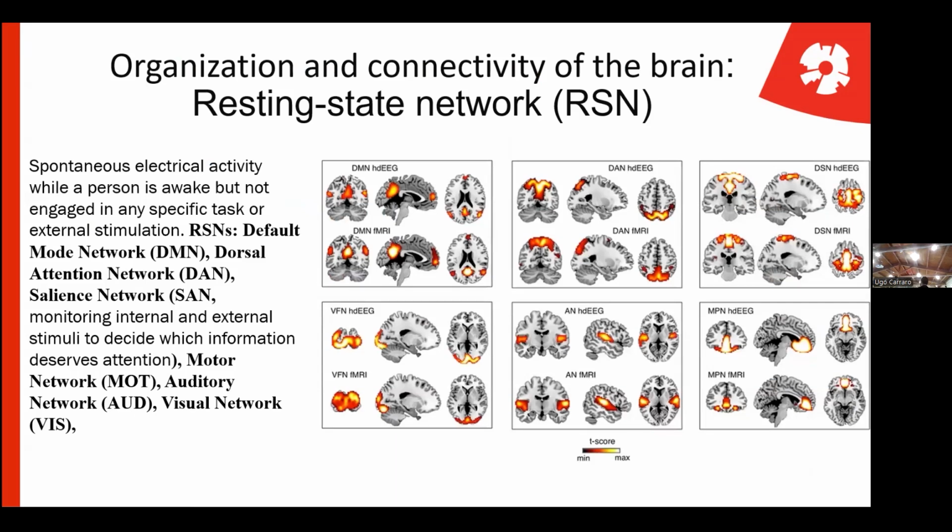Now, for the latter part of the presentation, I need to give you two pieces of information in order to understand what is happening in the results. The following slides talk about brain connectivity, so about the activity of the brain along the different areas of the brain. So it's a way to develop electrical activity from EEG. But how can electrical activity, by means of connectivity, be modeled?